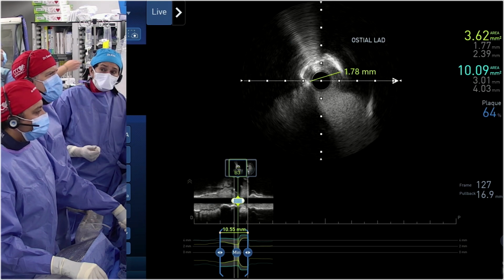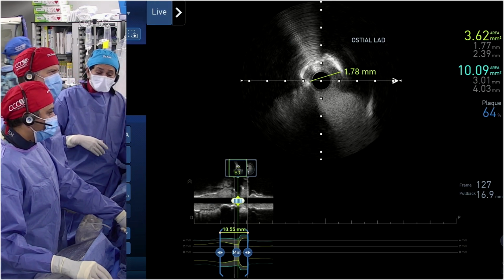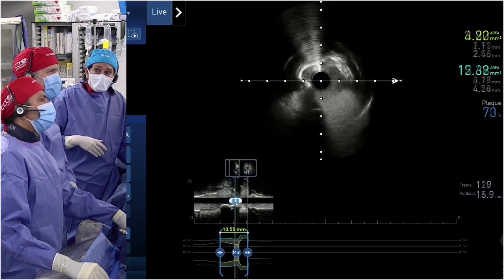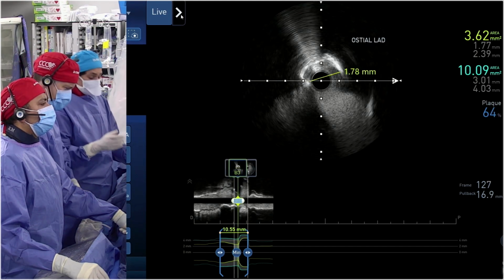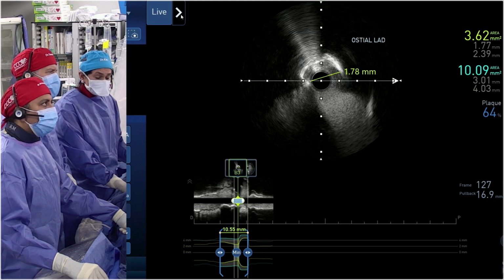Why do you need support? You can just do atherectomy. Now the question will come with this kind of stuff. It's a short lesion. Do you want to do atherectomy or directly go to IVL? Yeah, that's what I was sort of thinking about. Based on the imaging, would you be choosing IVL as opposed to atherectomy? Dr. Khanna, how would you approach something like this, Parveen Khanna?